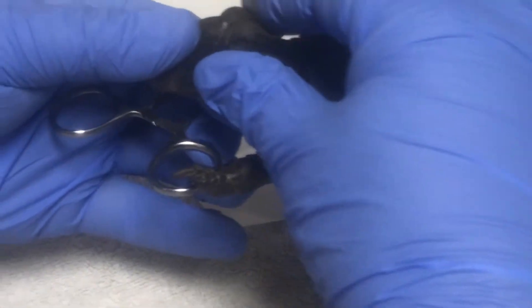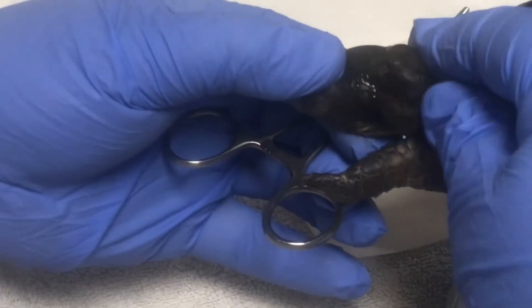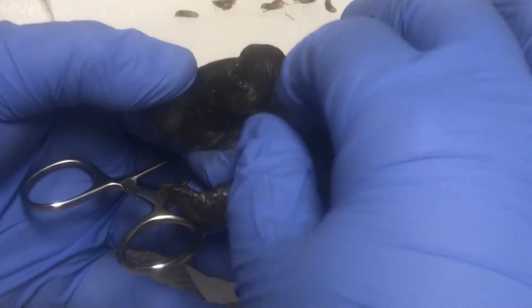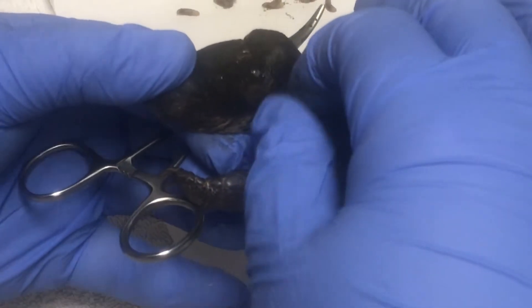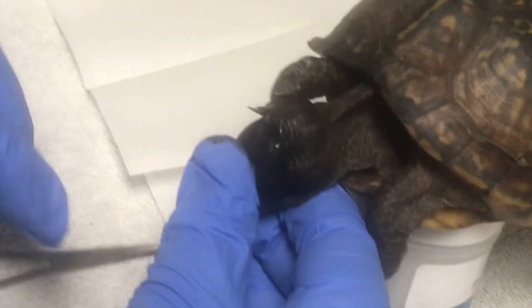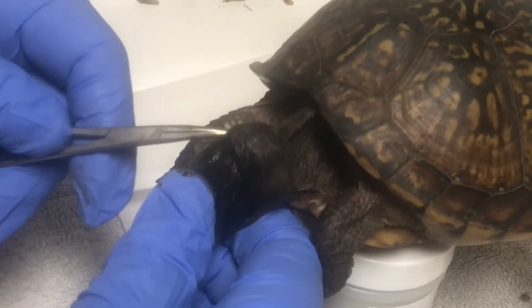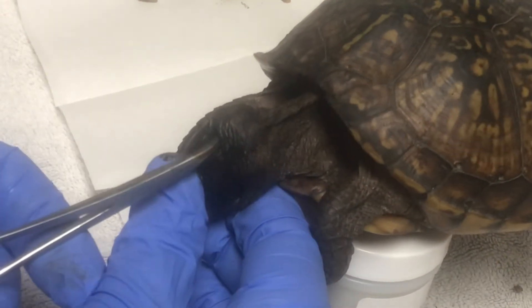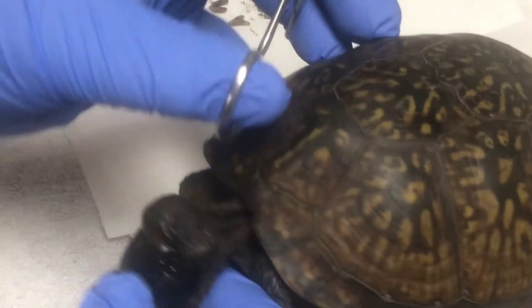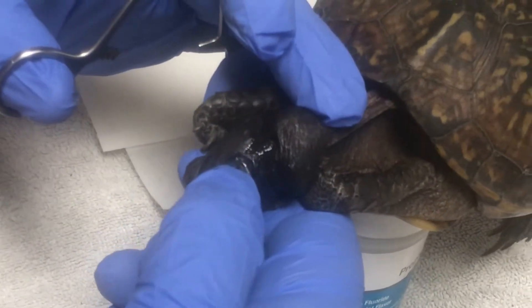Someone asks: 'You sedated him?' Yeah, a little bit. Wait, I see one sticking his head out right there. Oh no. Where is that tube coming from? Oh, there's another hole. Look at that — another hole. Those bastards are everywhere. Is there another hole on this side? Because we're finding a pocket that I can't get into.